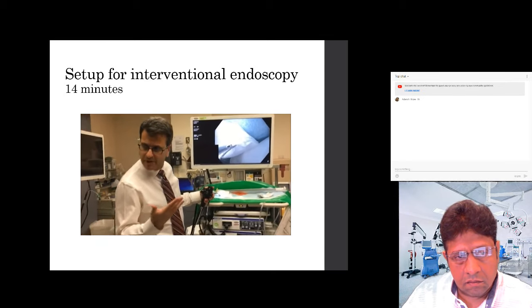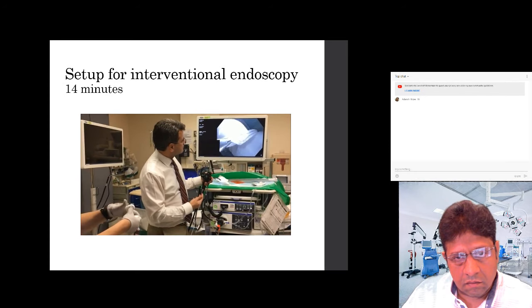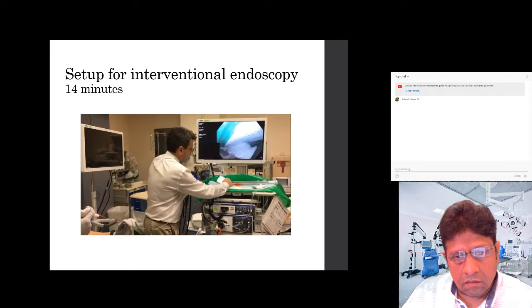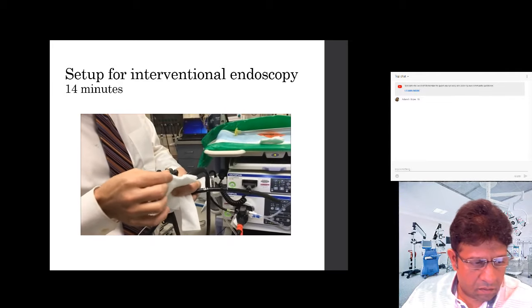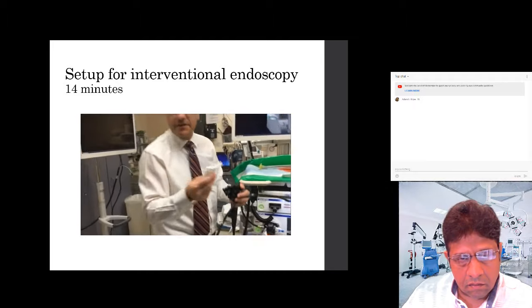Can we deploy one there? Yes. So let's just deploy it then. We'll let it go. Then we just push it inside. And that's it, the clip. And now if you take a look, here's the clip on the tissue. And it's pretty good. That's not coming off. I mean, it'll eventually fall off. But that's how we deploy the clip.